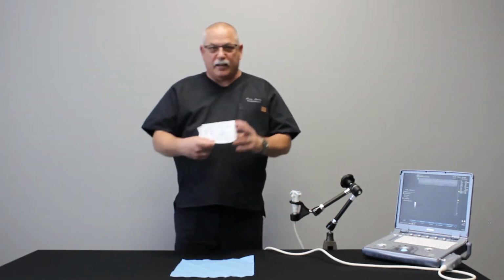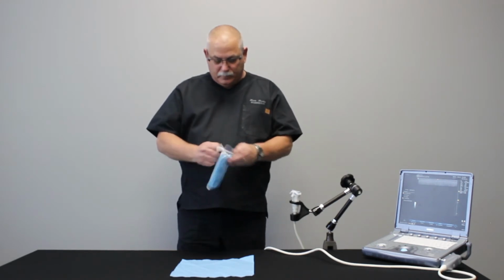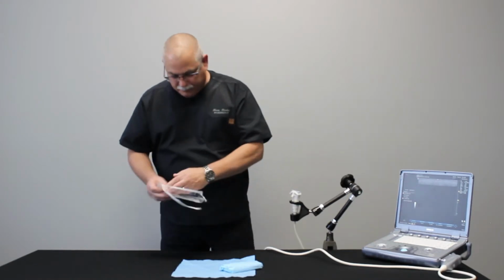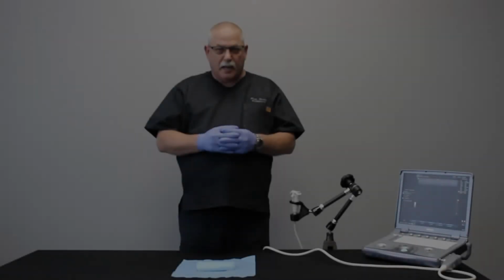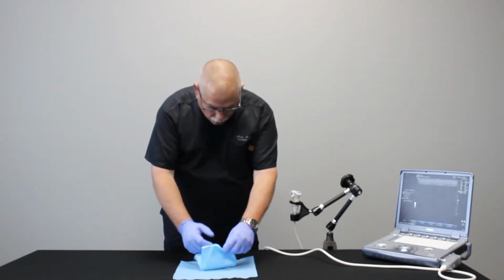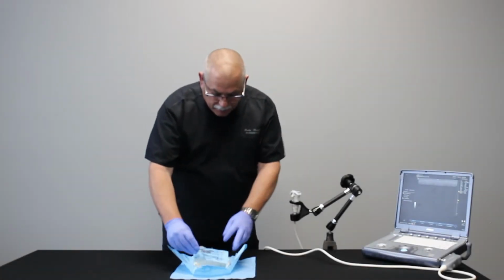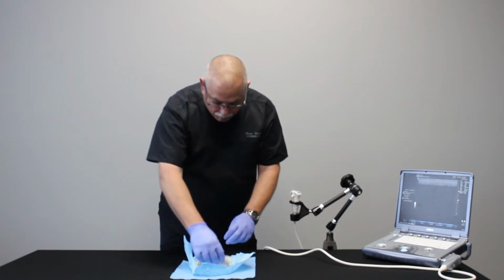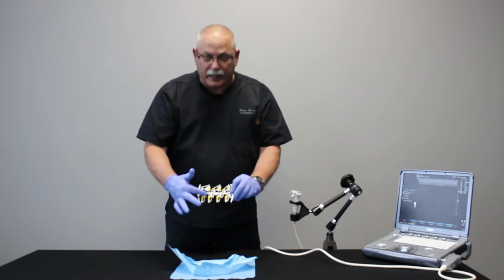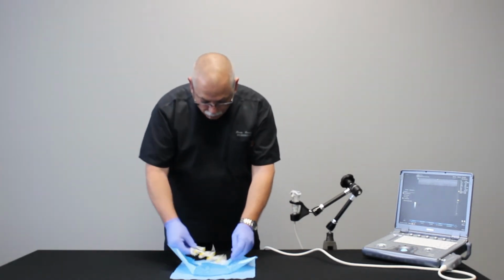Next, I'm going to open the Sterile Procedure Kit and drop it onto my sterile field. Now I've put on sterile gloves, so the rest of this will be a sterile technique. Open the package. Inside you'll find several things: sterile gel, a sterile probe cover, elastic bands, and then the AccuSITE Guide tree that has several depth selections. I'll explain more on that in just a moment.